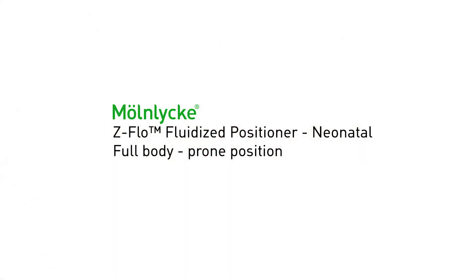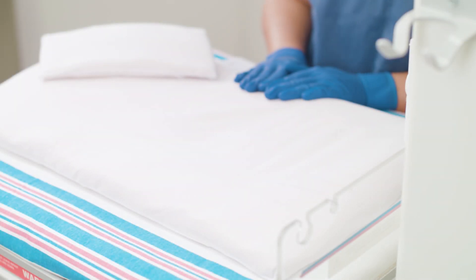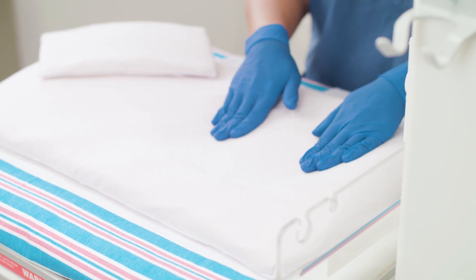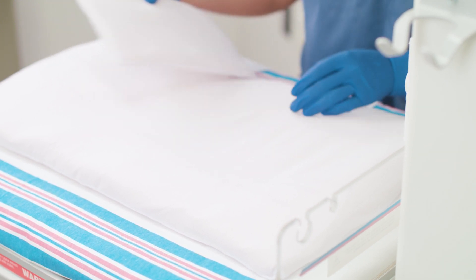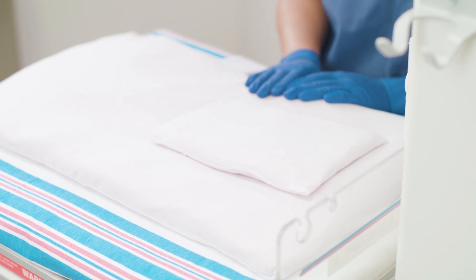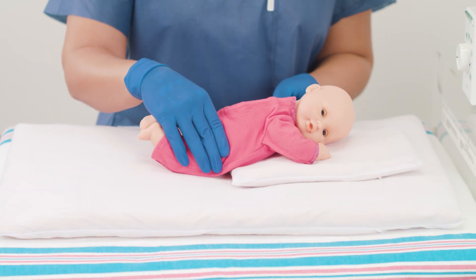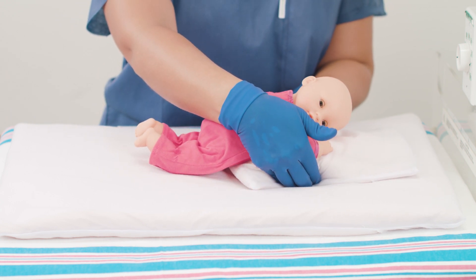For prone positioning using the full body positioner, there are two options. Option one: using an additional small positioner as a prone roll. Begin with the larger positioner flat. Use your hand to create an indented area in the center of the positioner that is the size of the small positioner — centered horizontally but more towards the top end vertically. Place the small positioner in the indentation. Place the infant on its stomach on the smaller positioner with the baby's umbilicus at the bottom border of the positioner, so that hip flexion is encouraged.